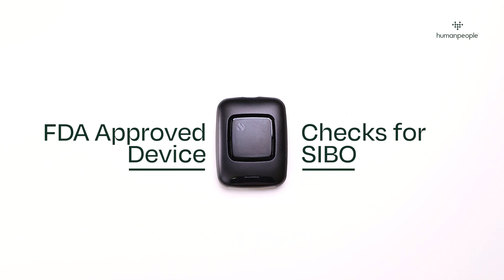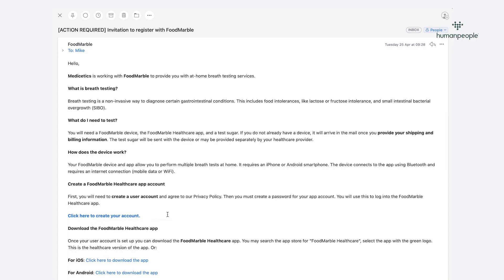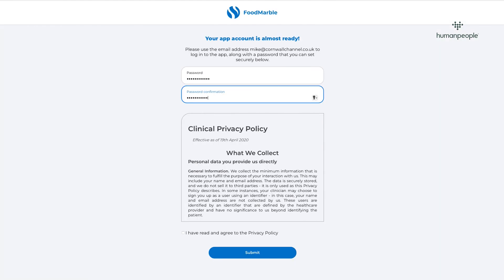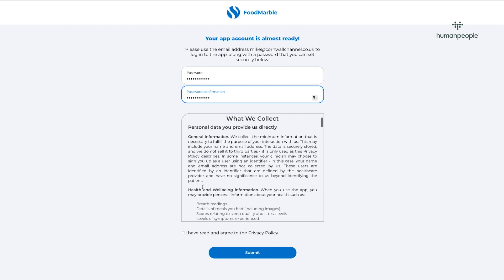First, you'll receive an email like this from your doctor. You then need to click the accept link and follow the account setup in order for your data to be sent for analysis. Once you're all set up, let's take a look at what you'll receive inside the box.